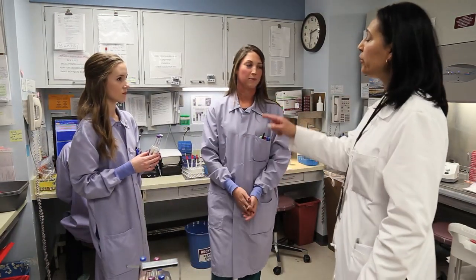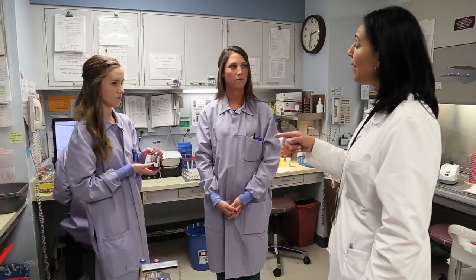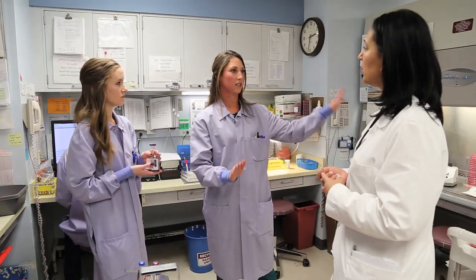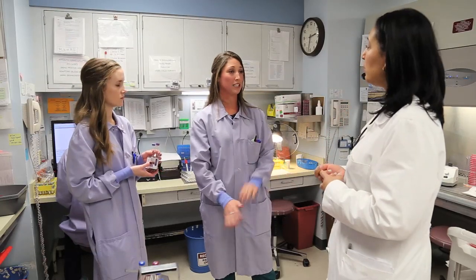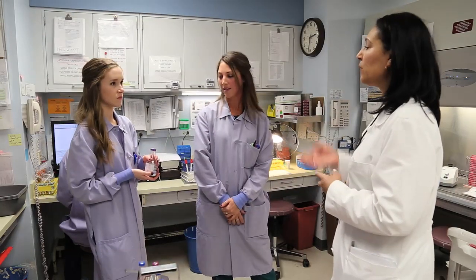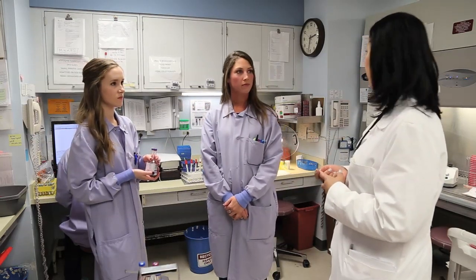Oh, wow. And these are the Bactec bottles? Correct. Yes. We're going to talk about the Bactec blood culture machine a little bit later. And that seems to increase your work, and it will extend the time for our blood culture results. Yes, and it could theoretically cause issues with mislabeling, like the wrong patient or the wrong bottle number, and you just don't want to get into any of those types of problems. So this is really important for patient safety and patient care.